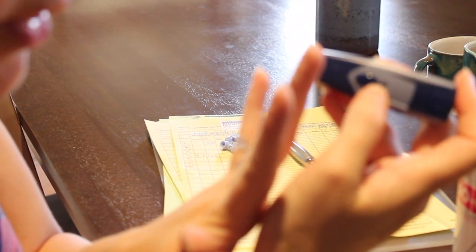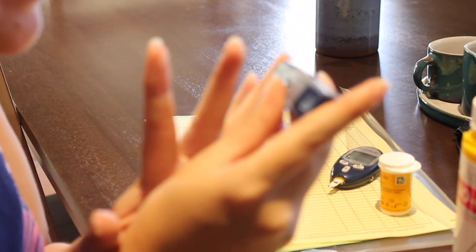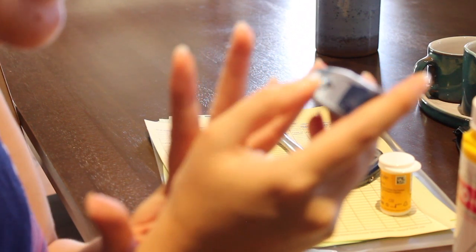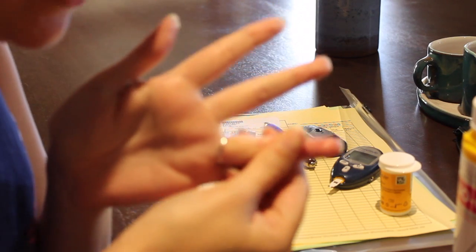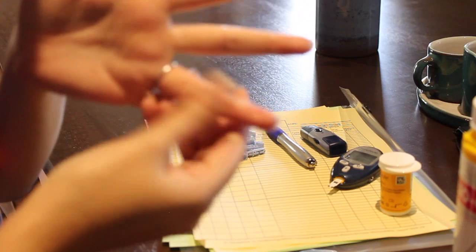Now this button here, right under the number, okay, it's loaded already. We heard it click. You're going to make sure you keep it pressed firmly and you do not pull away. All right, you don't want to have to do this again. So let's get it on the first try. All right, here we go. Ay. It's not too bad. Oh, look at that. That was a really good one. Putting on a show here.